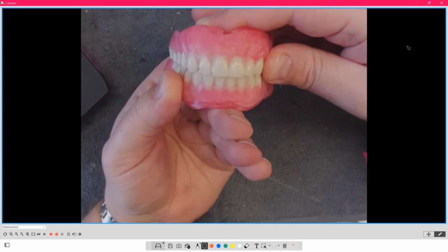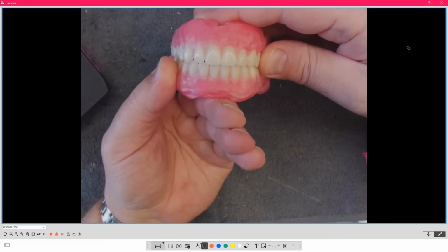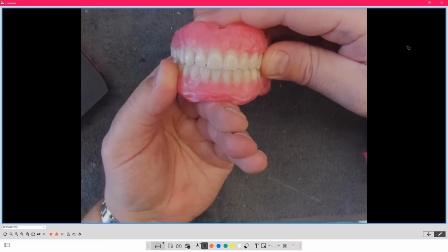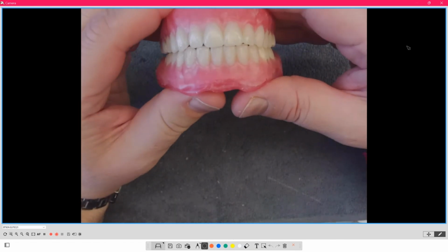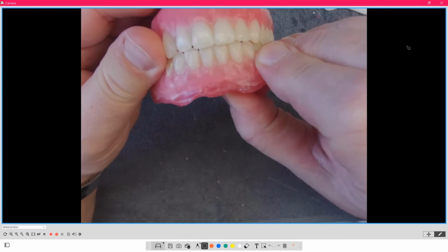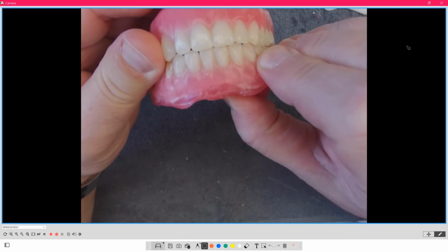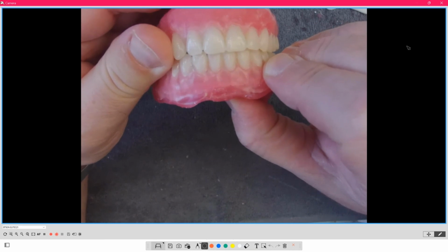Okay. In centric. There it is. It's hard to do in your hand. Okay. And it's very minute. It's about a millimeter in centric, so that you can hold the teeth together and you can gently wiggle these things in centric, okay?